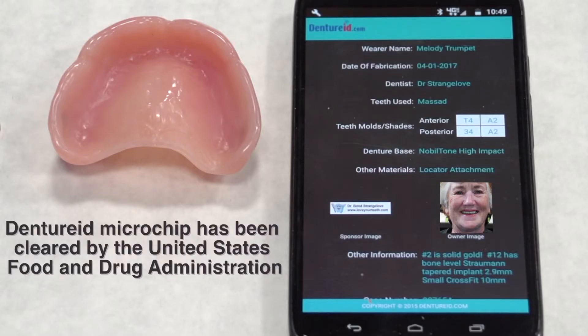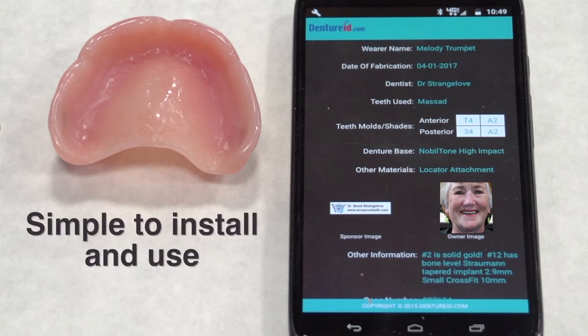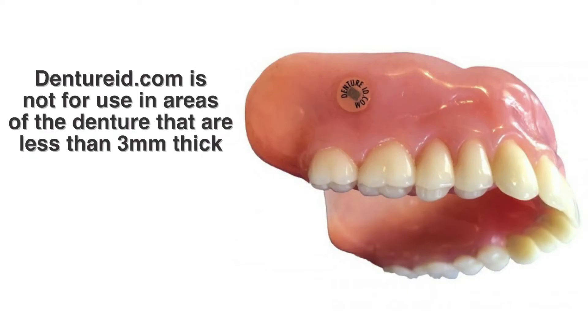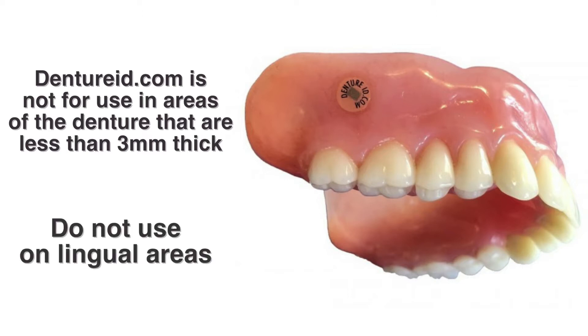DentureID.com microchip has been cleared by the U.S. Food and Drug Administration. It is simple to install. Please note that DentureID.com microchip is not indicated for use in areas of the denture that are less than 3 mm thick. Do not use on lingual areas.